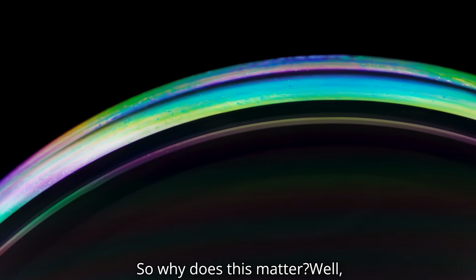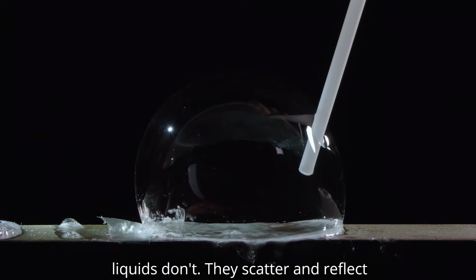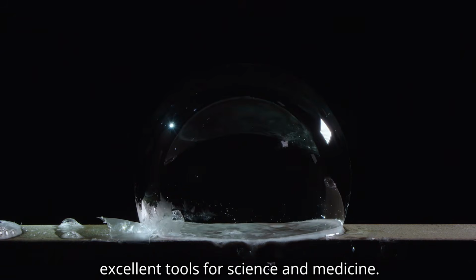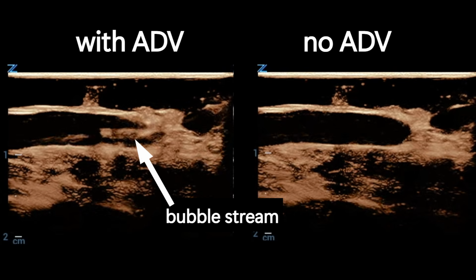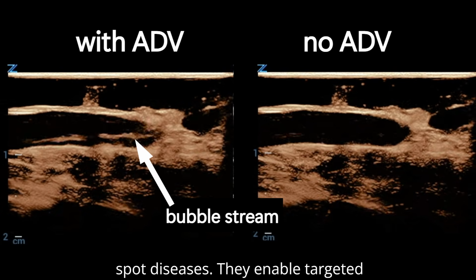So, why does this matter? Well, bubbles interact with sound in ways that liquids don't. They scatter and reflect ultrasound strongly, which makes them excellent tools for science and medicine. They provide sharper ultrasound imaging. These bubbles can light up ultrasound scans, making it easier for doctors to spot diseases.